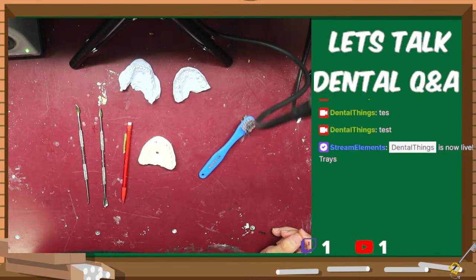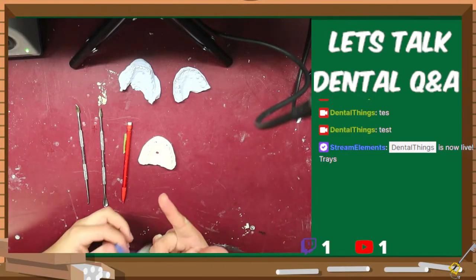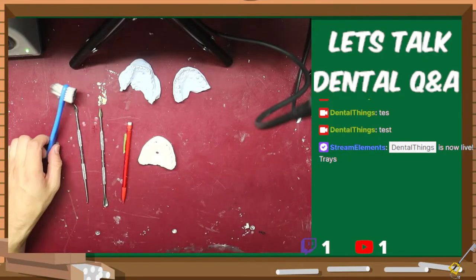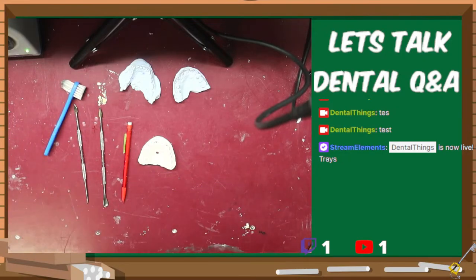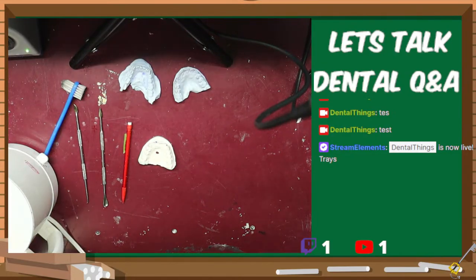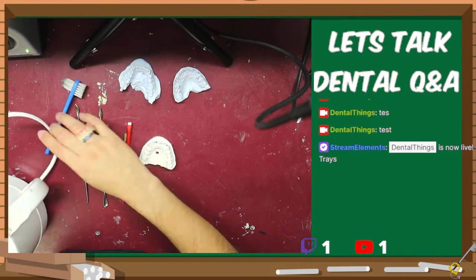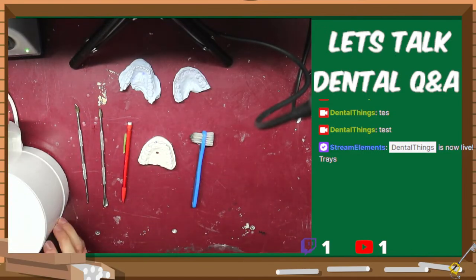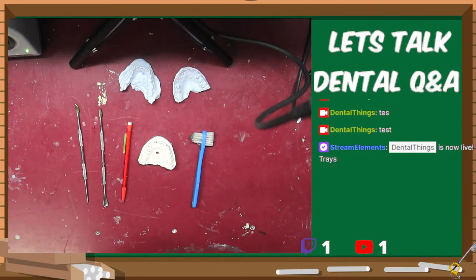That fan feels really nice right there. Good stuff. All right, so what I need to do with this is I need to boil out. I need to get some water to boil the wax off of this. And that shouldn't take too long to boil. Let me go and fill it with water. Yeah, I need new water with this. Just a moment.